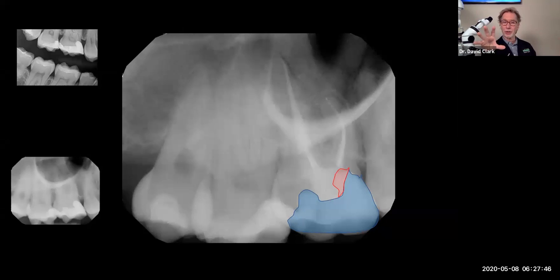So in endo teeth, you're going to need 2 or 3 layers. You're going to have to put bulk fill flowable down over the stumps before you do anything. And sometimes I can just do it with double shot, but you have to get that bulk fill flowable into the stumps, covering the floor, cure that, and then injection overmold, because you're way deeper than 4 millimeters on the occlusal. Good question. Other questions, Josh?